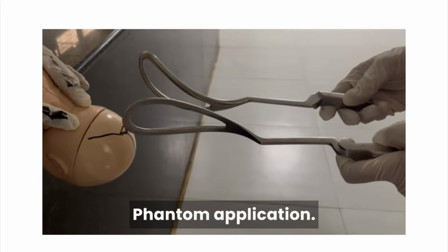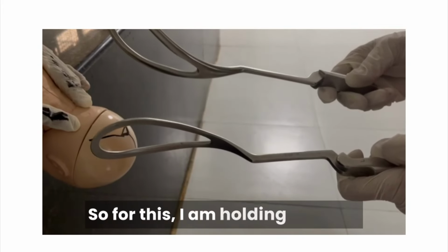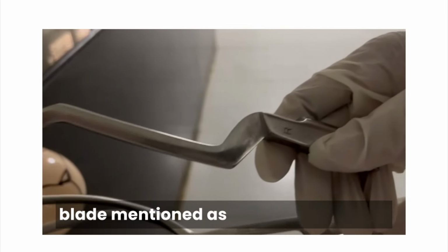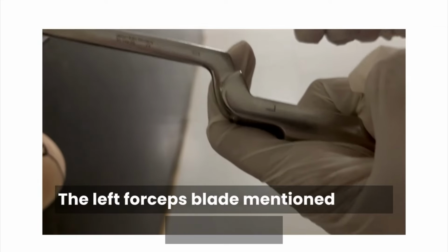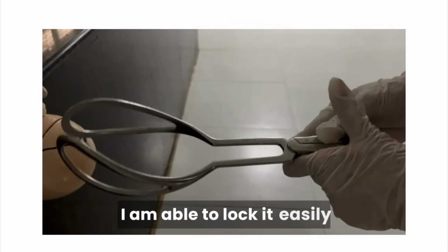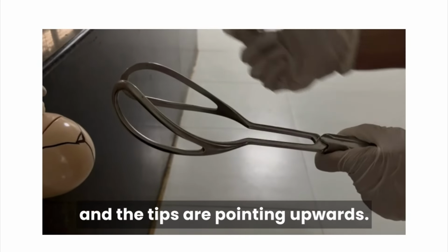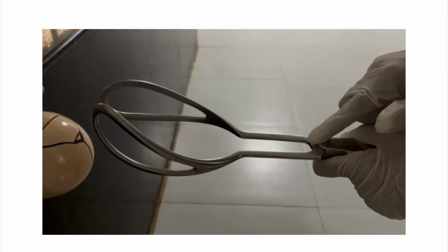Phantom application. This happens in front of the mother. So for this I am holding the right blade, mentioned as R, in the right hand, the left forceps blade, mentioned as L, in the left hand. I am placing them in front of the mother. I am able to lock it easily and the tips are pointing upwards. That means these are the correct blades. The equipment check has been done.